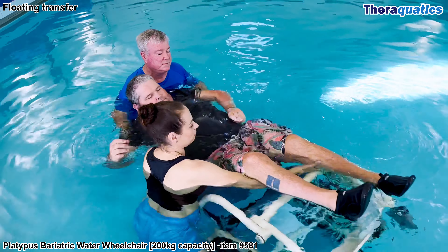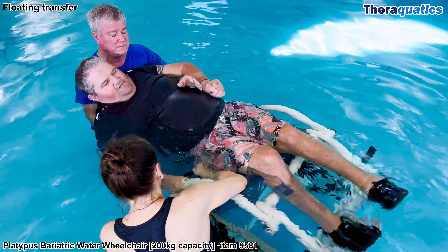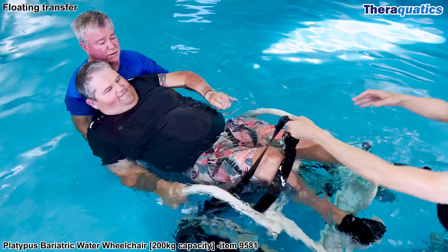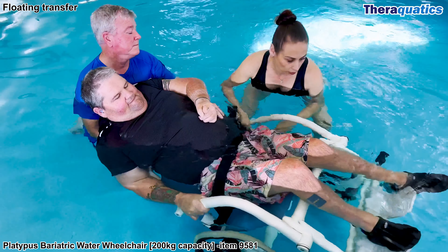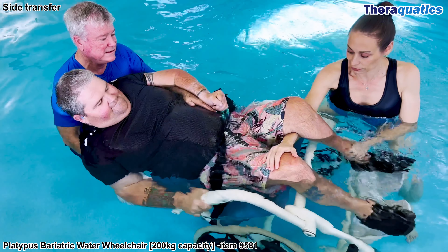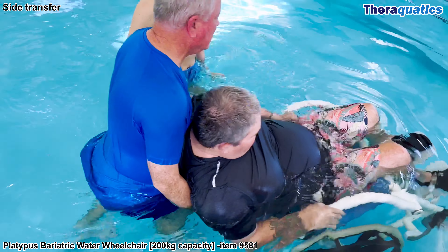To exit the pool, float the swimmer over the chair in the shallow end of the pool while the support worker holds onto the swimmer. The support person secures the belt, ensuring the swimmer's bottom is back into the chair, and then positions the feet onto the foot plates.